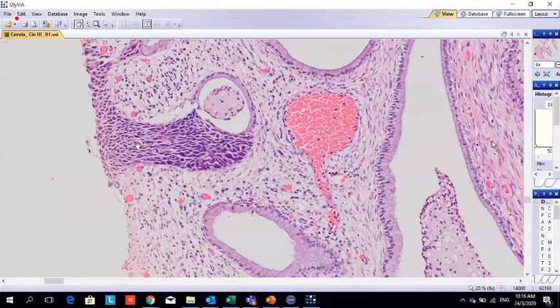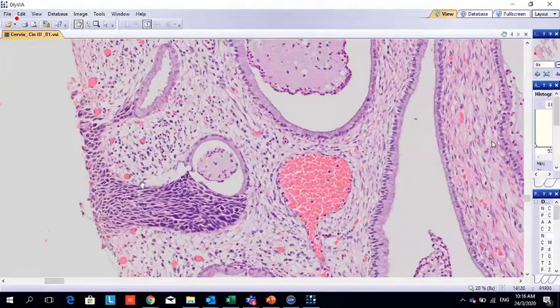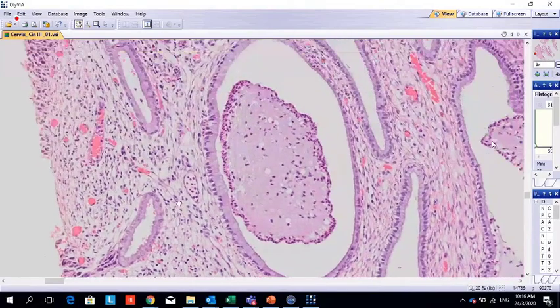And this one, the CIN started to extend through the gland. Yes, this is extension actually, it is not invasion. Invasion should break the basement membrane and invade the surrounding.